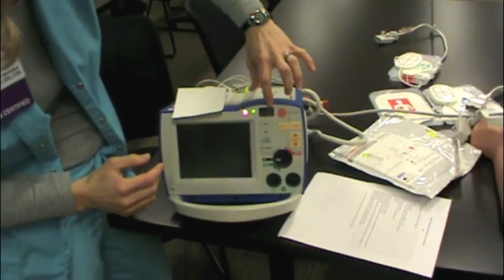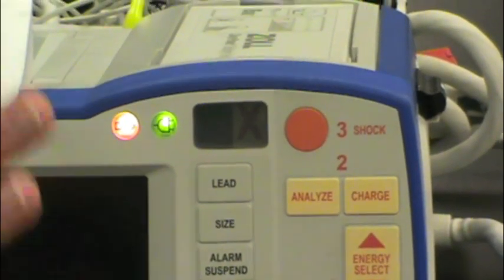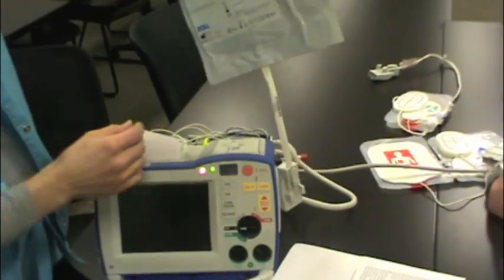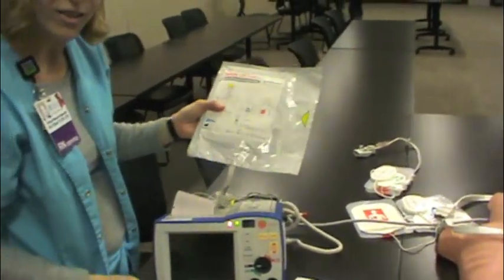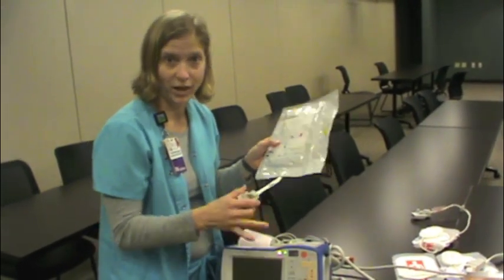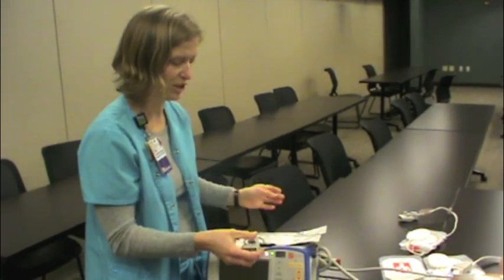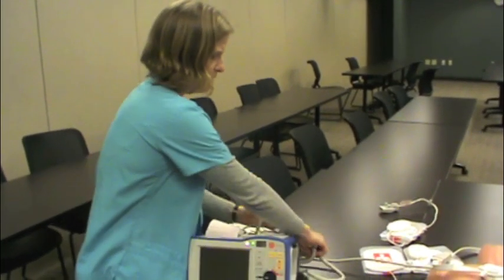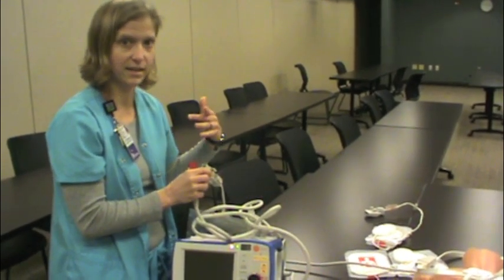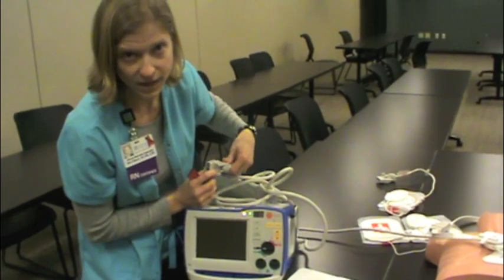Right here on the front you'll see this red X. This is a very smart machine — every morning at three o'clock in the morning it will silently wake up and run through over a hundred self checks. One of those checks involves knowing that the pads, which are supposed to be continuously plugged into the machine, haven't expired — it will check the expiration date and let you know. It will also do the daily defibrillation check, delivering a 30-joule shock automatically. Last night it wasn't plugged in, so instead of a green check mark we have a red X saying it failed its self test.